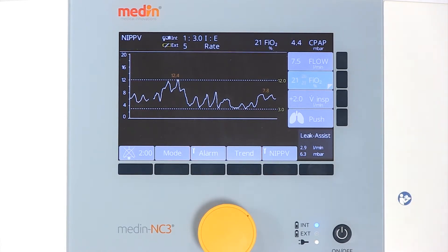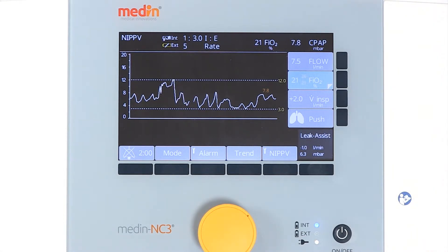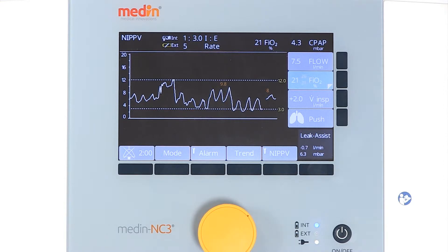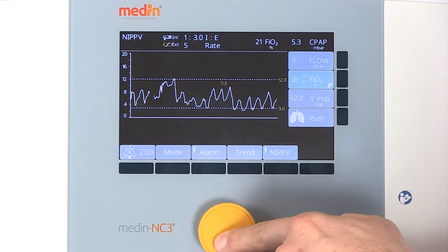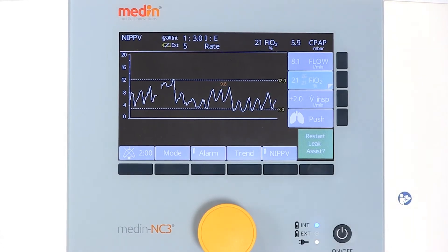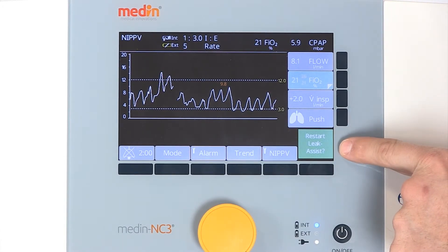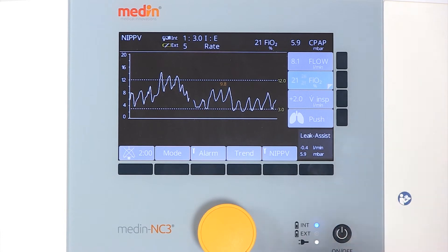The Medin NC3 compensates leakages with flows of up to plus or minus 5 litres per minute around the set target pressure. If the CPAP pressure is changed, the leak assist function stops and an information window will prompt you to restart it. A tight-fitting CPAP system and efficient application guarantee a constant CPAP pressure and effective leak compensation.